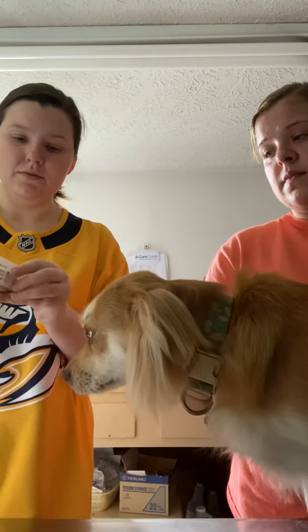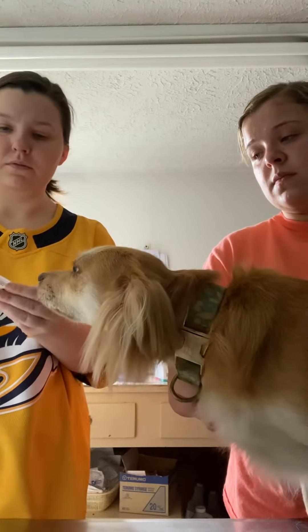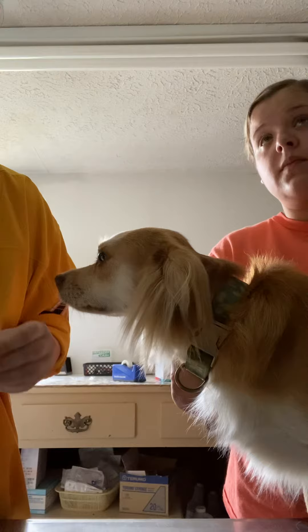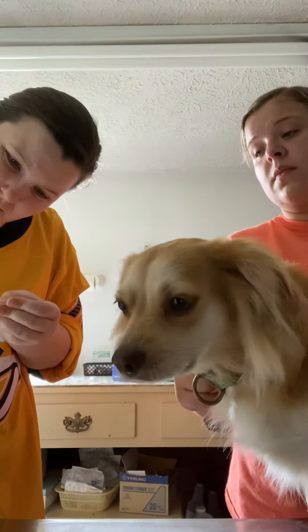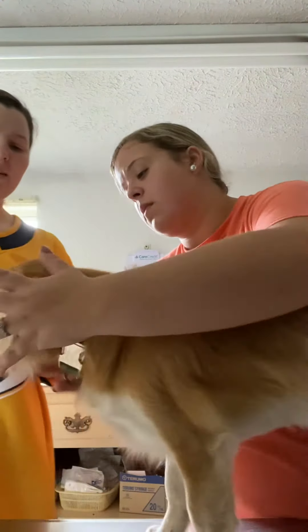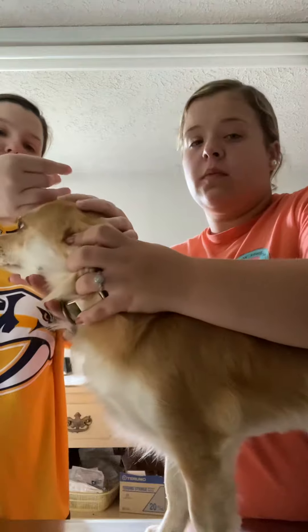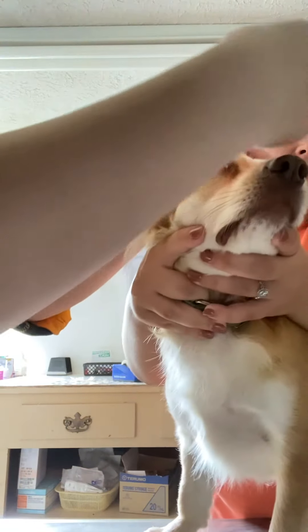I'm going to take it out and I'm just going to drop some of the ophthalmic solution, and then I'm going to lift the top eyelid and hold it. She's got it — just hold it for one, two seconds.